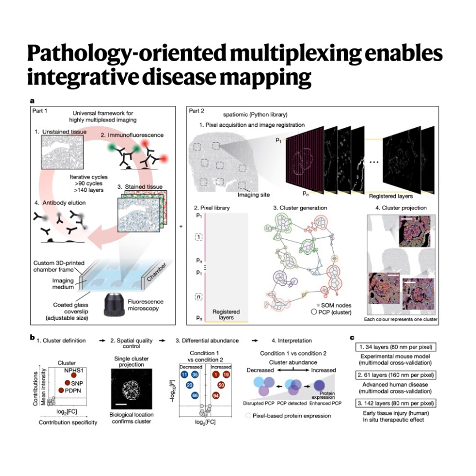So you've got this incredibly detailed map. Let's see it in action. How was PathoPlex first used to find something genuinely new and maybe even actionable in a disease? You mentioned kidney disease earlier. Yes, the first big test case was in an experimental mouse model of a really severe kidney condition called crescentic glomerulonephritis, or CGN. It causes rapid kidney failure.